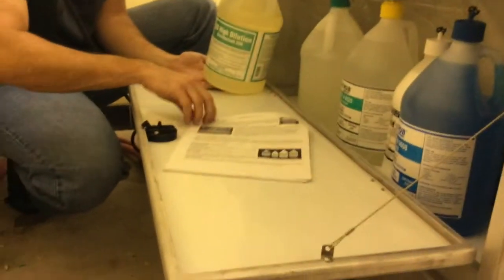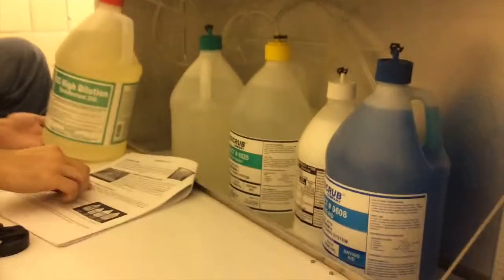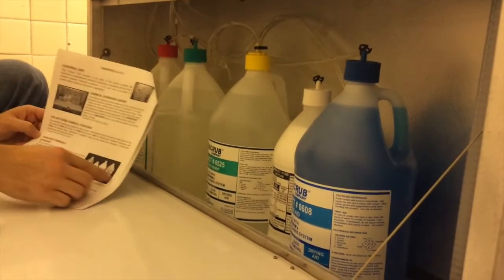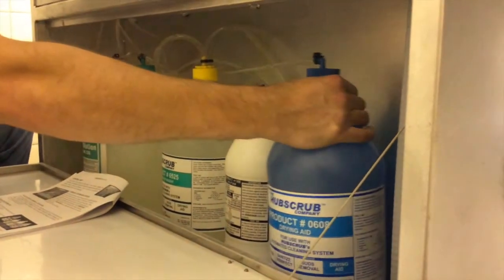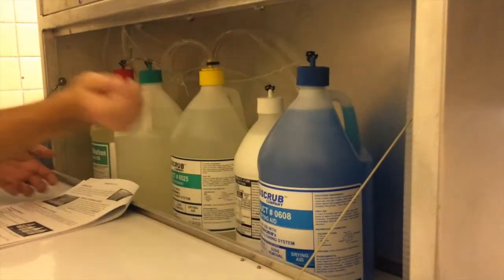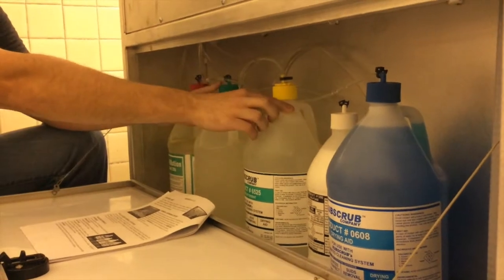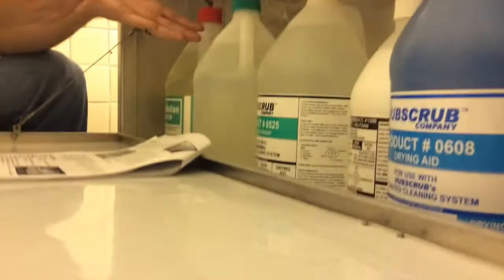This page here has the control unit for the chemicals — they are all color-coded. For example, you've got a red cap, and that is for disinfectant, which it says right on there. The drying aid has a different color. It could be the cleaner, sanitizer, sud removal, or drying aid. Drying aid has a blue cap. The green cap feeds cleaner into the entire spray arms for the automatic wash. The yellow cap is for the hose to do something individually quickly if you wanted to.